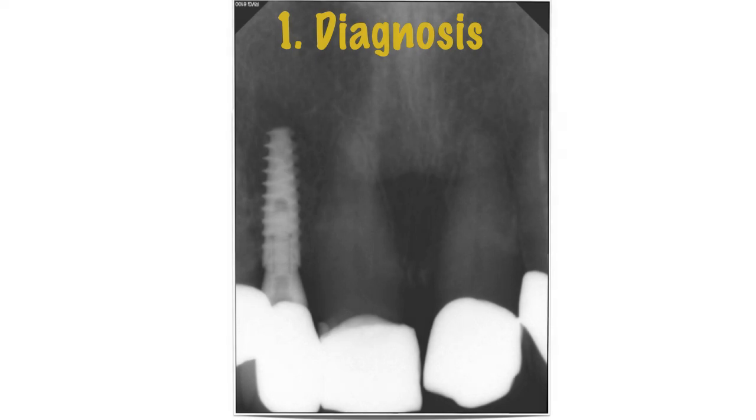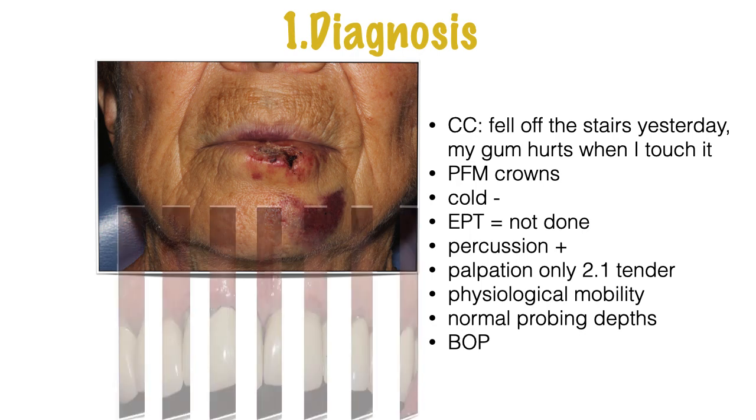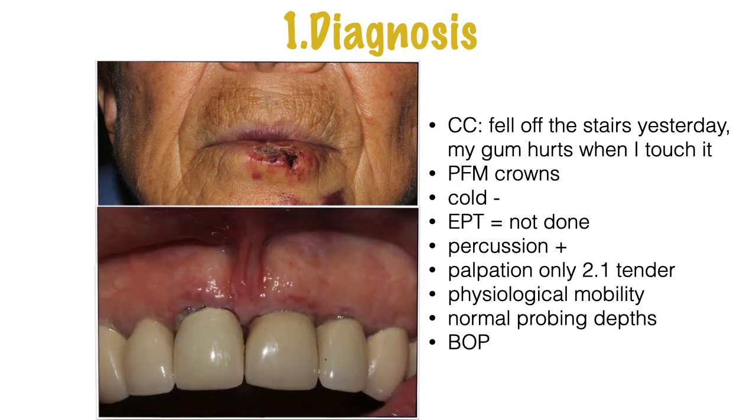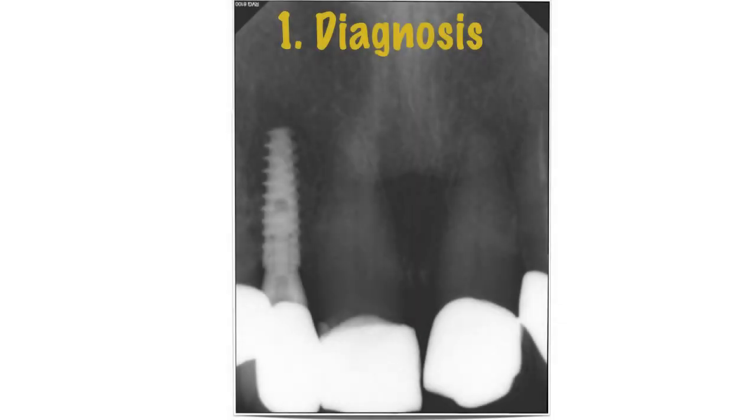So the PA was taken, and we were kind of focusing on tooth 2-1. Again, the pulp chamber wasn't the greatest. We don't know what's underneath it, if there's even a pulp chamber there to capture the cold test. So for the cold test, all teeth responded negative. So are all teeth necrotic, or is the test not being reliable?